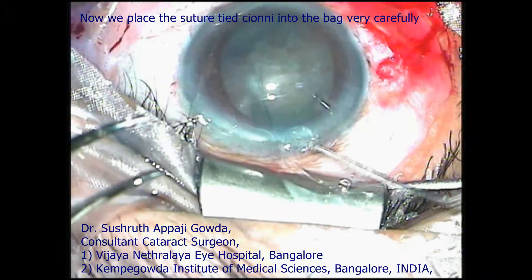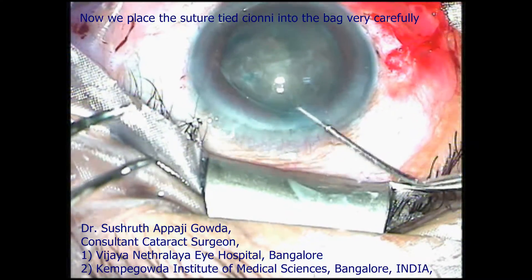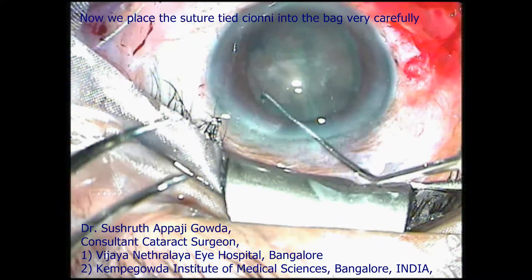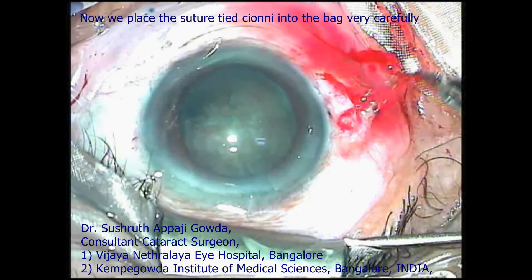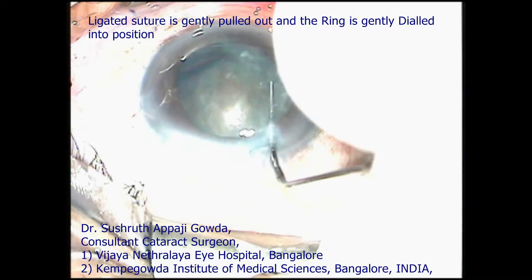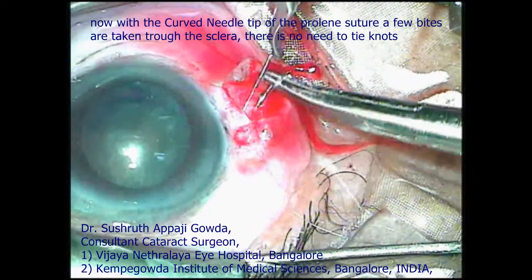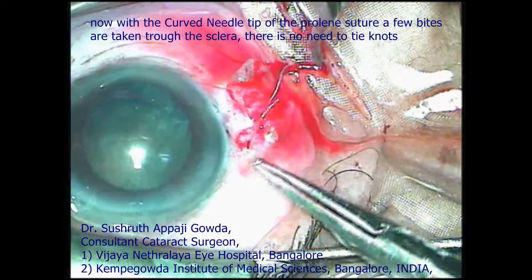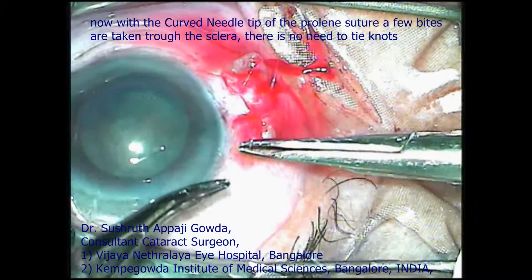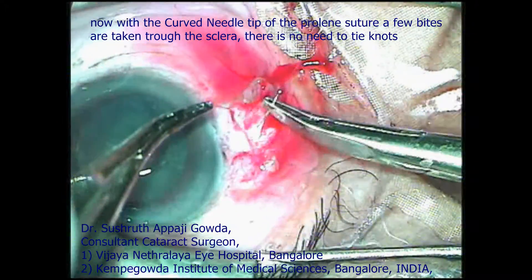The Cionni ring is gently tucked into the bag and gently dialed into position. The suture is pulled to place the bag in the right position, and a couple of bites are passed through the sclera so that even tying knots can be avoided this way.